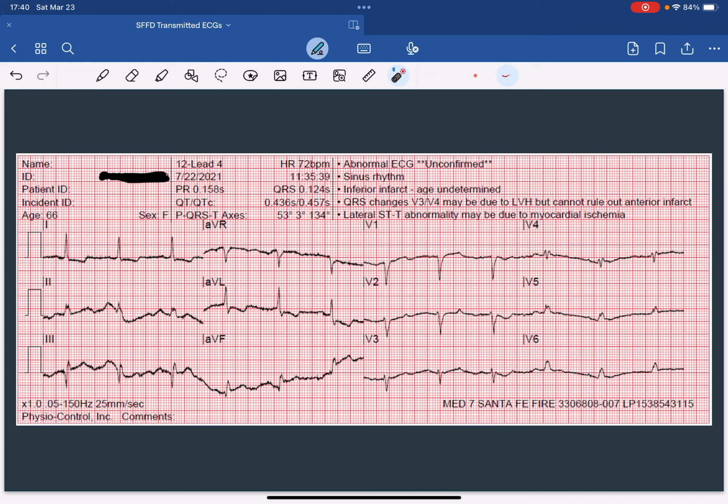But remember, if you get a crummy-looking 12 lead, take steps to remediate that and get a cleaner one. But if it were me, I think I have enough information here at hand to not only manage this person for ACS, but also to activate a STEMI alert.